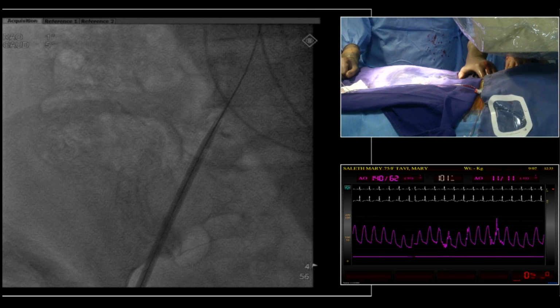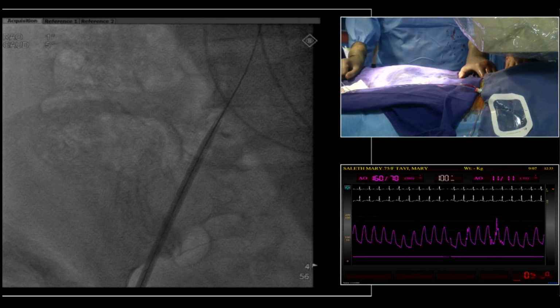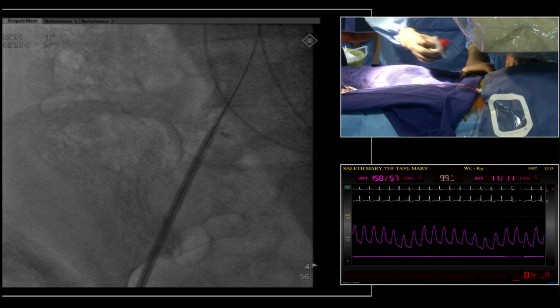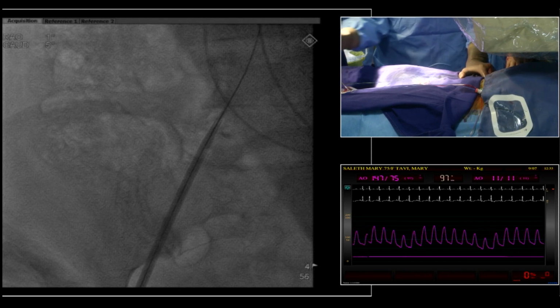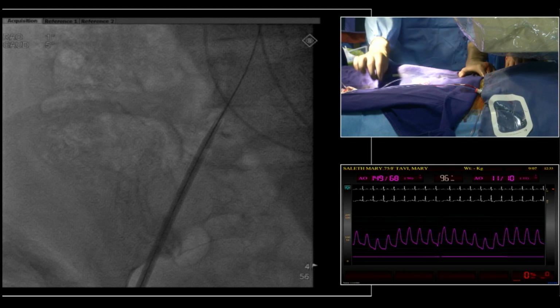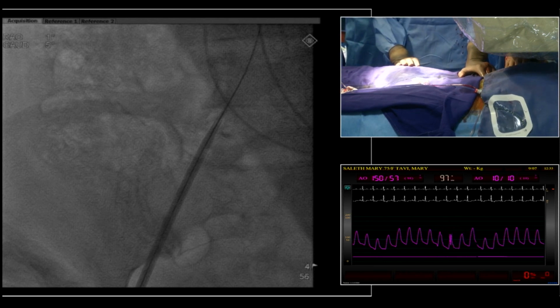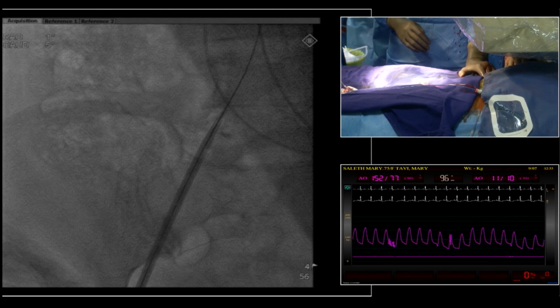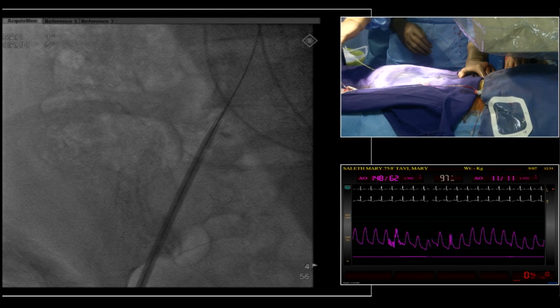There are advantages of it. The advantages are that firstly, you're able to feel the vessel. Secondly, if there were any areas of narrowing, you're automatically stretching them. It allows you to get the feel of how your sheath will track up, and therefore it gives you a good idea about straightening of the bends and calcifications of the femoral artery to allow your valve to go up.